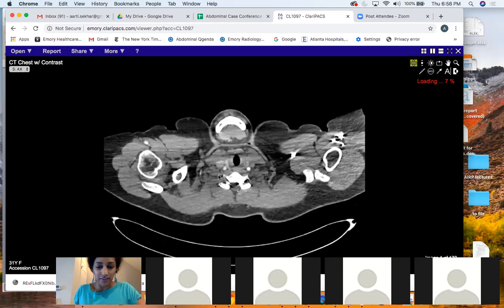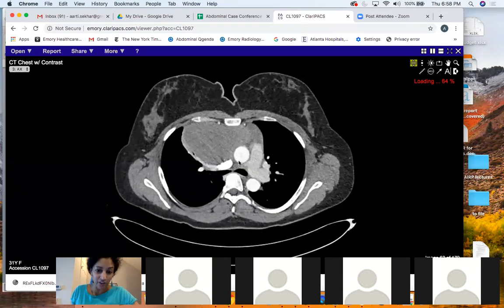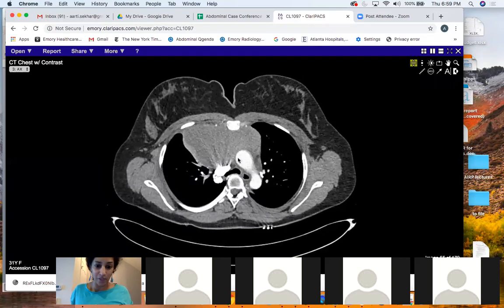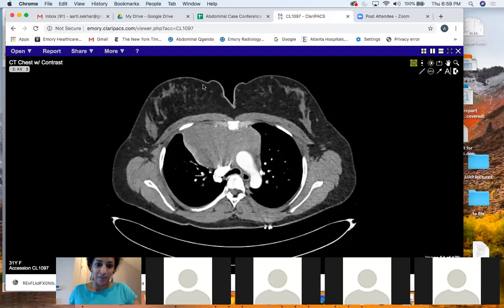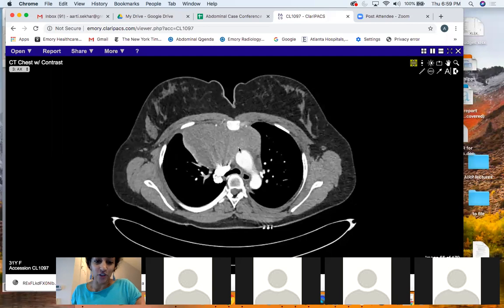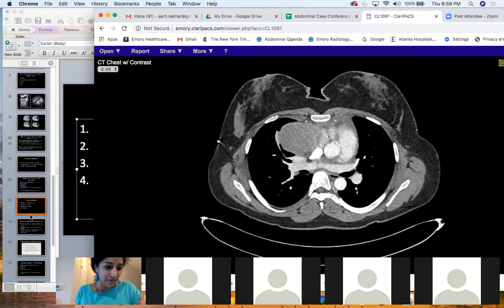This was a young woman presented with facial swelling and had this mass. This looks very similar to the first one I showed you, and I would have said basically lymphoma until proven otherwise. It's pretty bland. It doesn't have that much enhancement. We did like 6 core biopsies here, and we basically didn't get a diagnosis. And I was very disappointed. And they said it was paucicellular, and it didn't look necrotic, so I was very confused about it. She ended up going for surgical biopsy and resection of this mass, and this actually came back as a desmoid tumor or fibromatosis. So I have just a couple of slides about these.